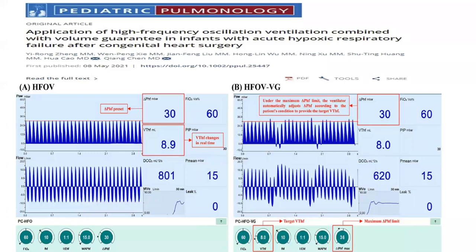I am Jamil Ghamdi, an ICU consultant at Al Bahri University. Just three comments about the use of high frequency in neonates, especially the nasal high frequency. We do use it as a non-invasive in neonatal ICU if we failed in NIPPV, non-invasive positive pressure ventilation, as a mode of weaning. So we use it as an alternative before we reintubate the baby, especially if the CO2 is very high in blood gas after extubation. This is regarding the nasal high frequency.